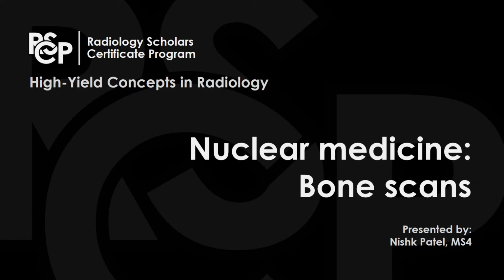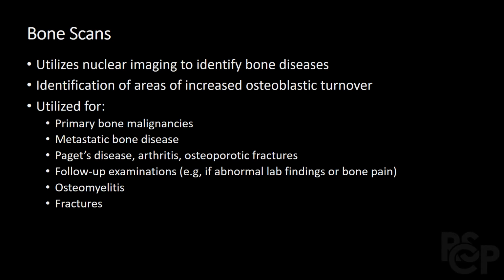Today we're going to be discussing bone scans in nuclear medicine. Bone scans utilize nuclear imaging to identify various bone diseases. They usually identify areas of increased osteoblastic turnover, which is then picked up by nuclear imaging.